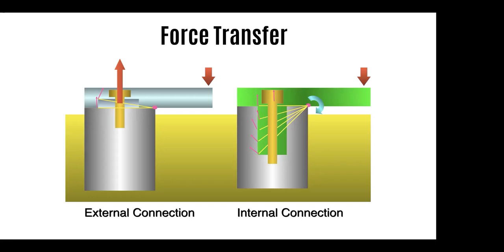But on the right, with the same fulcrum point at the end of the platform, the lever movement is resisted by this long axial wall inside the connection or inside the implant. That's why the internal connection resists much better to lateral forces or any dislodging or cantilever movements.